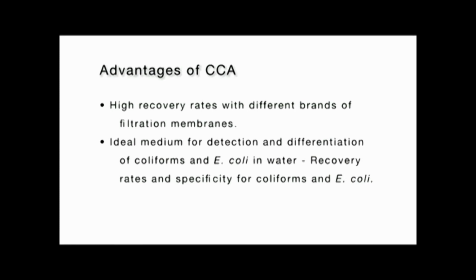The presence of Tergitol-7 and the addition of antibiotics cephalosporin and vancomycin, coliform CV selective supplement, reduces the growth of accompanying flora, resulting in excellent recovery rates and specificity for coliforms and E. coli. Also ideal for wastewater. With the new selective supplement, coliform CV, our CCA agar is even more selective, ideal for the analysis of wastewater and very contaminated samples. Better color contrast for easier interpretation.